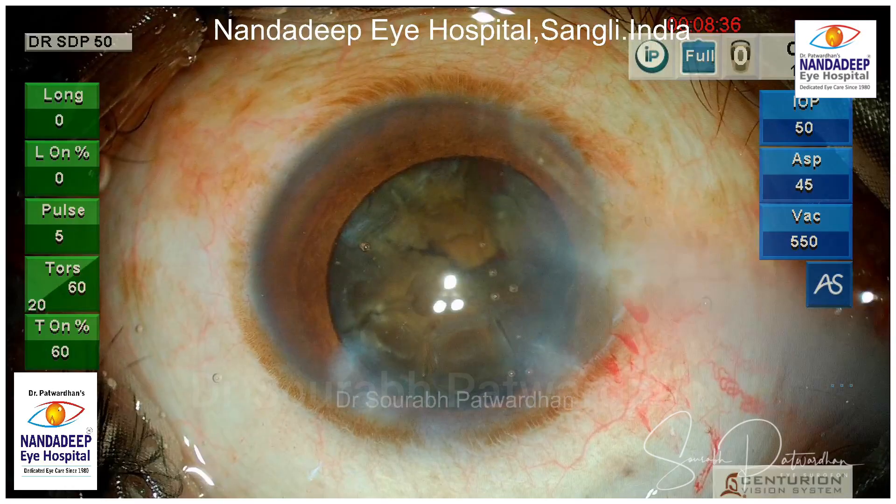This is the quadrant removal mode. I am going to use only torsional here, which starts from 20 up to 60 and 5 pulses per second. Torsional is ON for only 60% of the time. I am using fixed vacuum of 550 and 45 fixed flow rate and IOP of 50. I am using a balance tip throughout, that's why the power set very rarely exceeds 70.